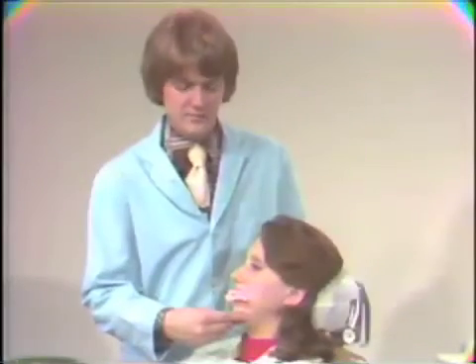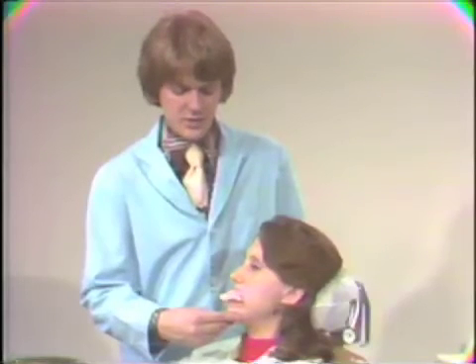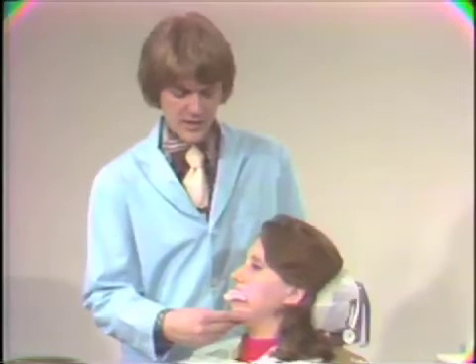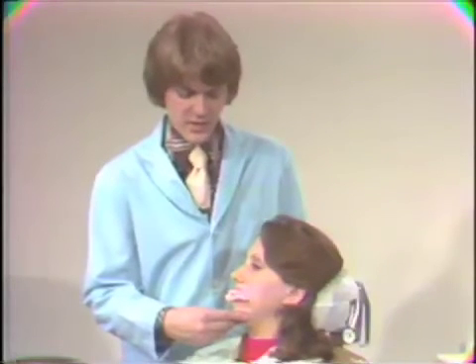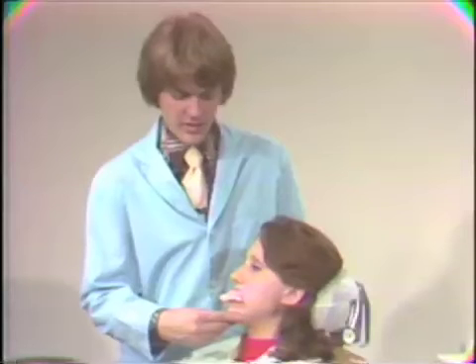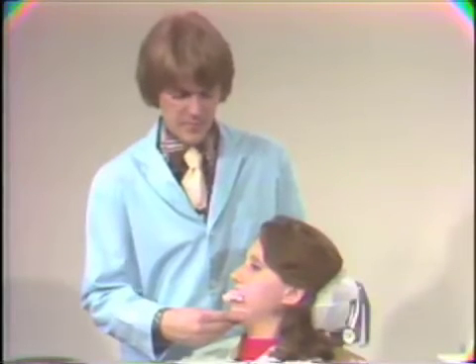Okay, then we'll go back, we'll paint in a real thin slurry of the same type of acrylic, the TMJ acrylic, and we'll redo our recordings. Again, studies have shown, and experience also has shown, that by doing this in 2 steps, you can get a more accurate stereographic recording, and it's easier to read.